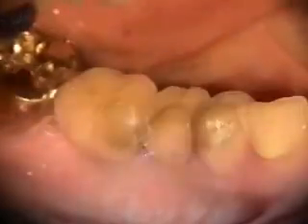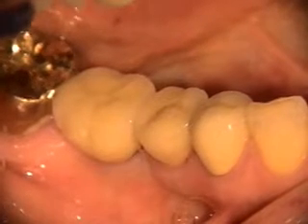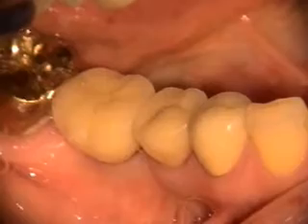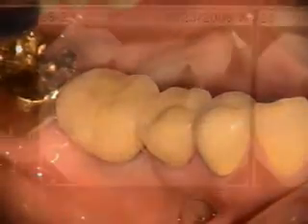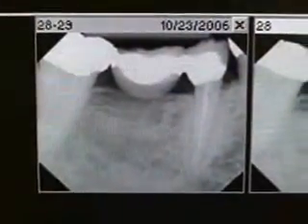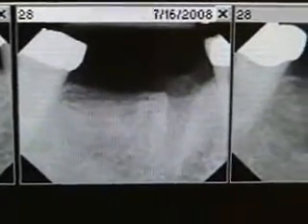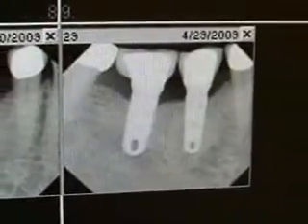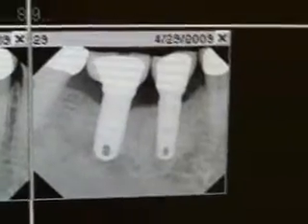Those are our two implants — they're going to be ready to be restored. These are the final restorations on the implants on number 29 and 30. So we started out with a failing abutment, extraction and bone graft, the healing of the bone graft, implant placement, and implant restoration.